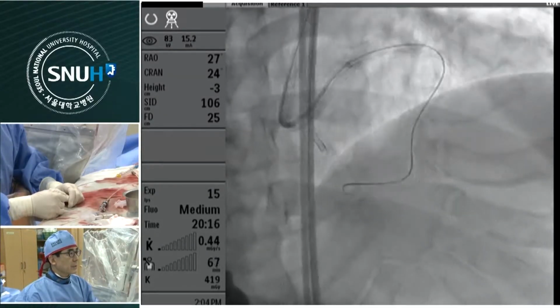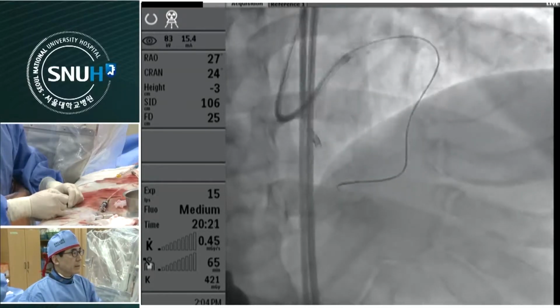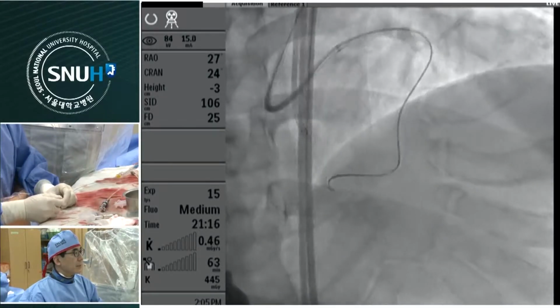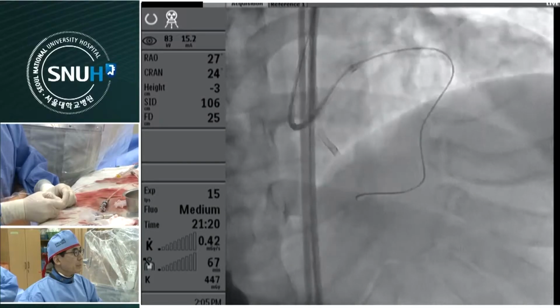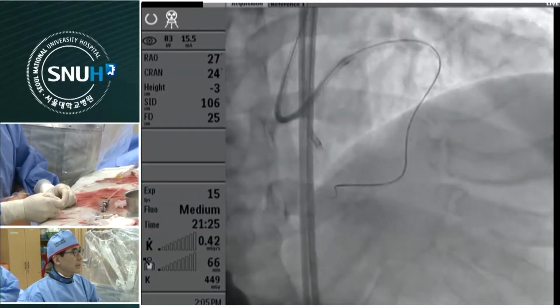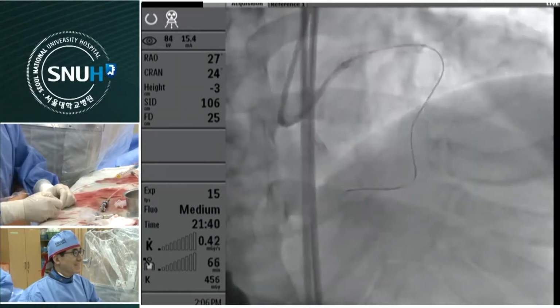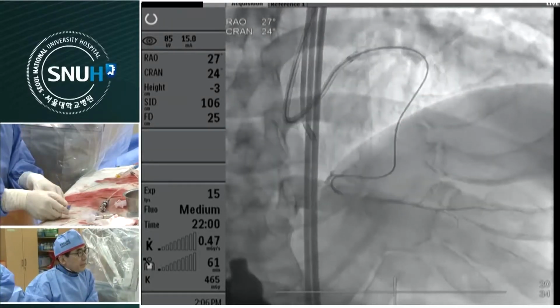Yeah, prolapsed. The anatomic morphology is very bad. It is more promising for this maneuver, but further manipulation may cause the prolapse of the wire into the right side, and further advancing into the left side is probably difficult. Circumflex, PL. Do you want to see this picture?